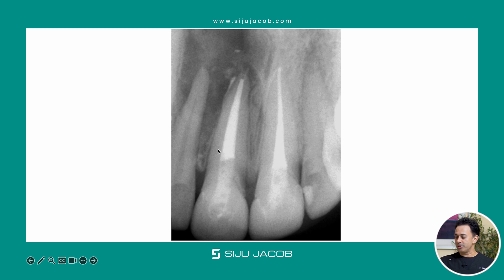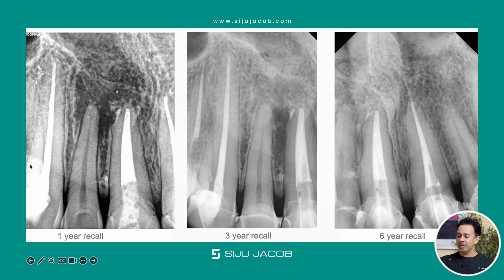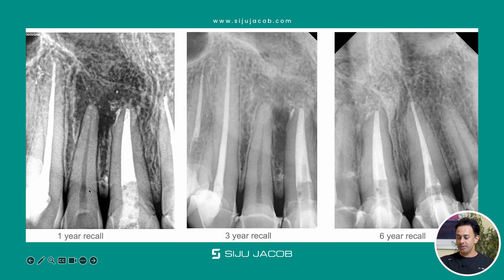You can see the post-obturation result here. We recalled this patient at one year, three years, and six years — and it works beautifully. This particular adjacent tooth maintained its vitality; we didn't have to do endo on it at all.